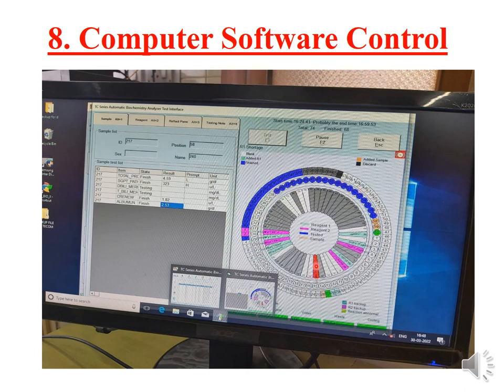A red mark means there is a warning, a green mark means the test has started, and yellow marks mean the test is yet to start. This is how the color-coded programming is done.